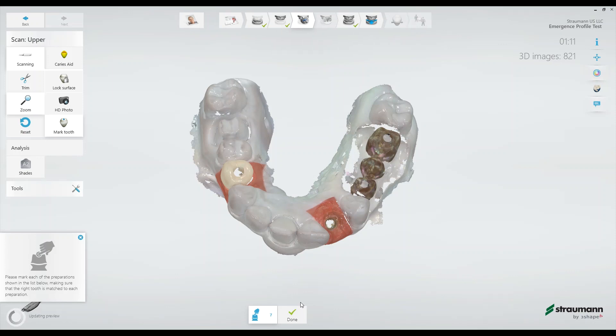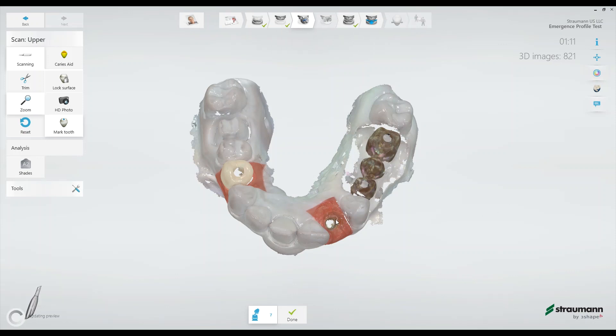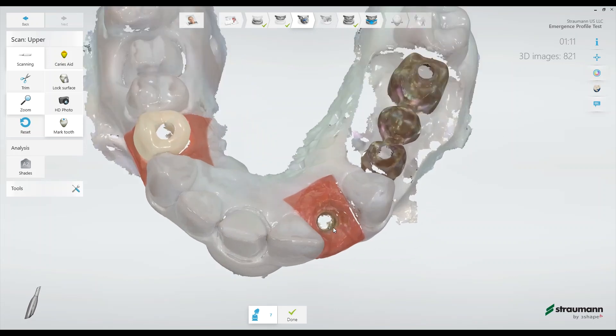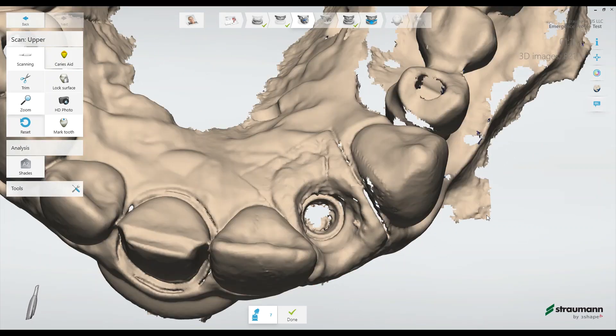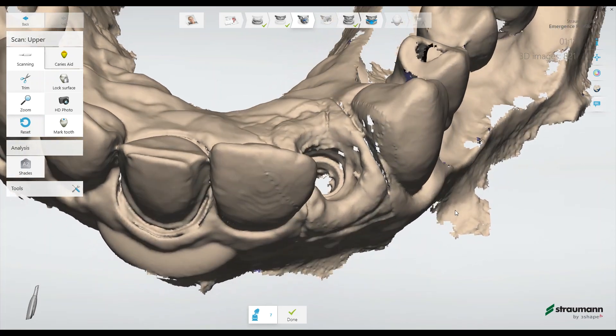By adding this scan, your lab will be able to make a beautiful custom emergence on a custom abutment. If I zoom up on the emergence profile here, and deselect the color, I can better see the capture.